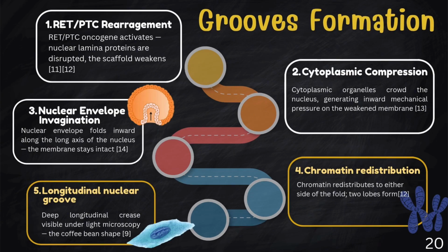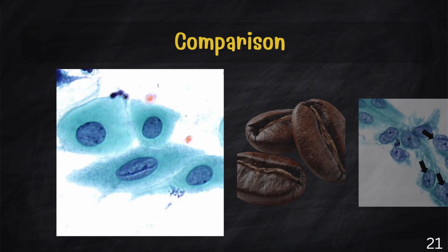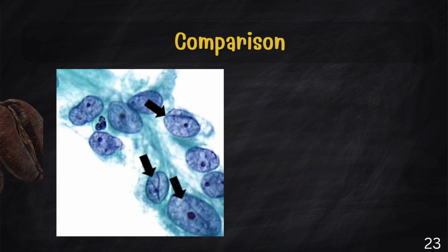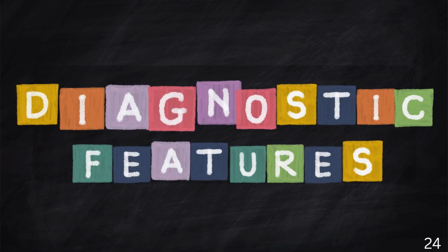It is important to remember that the groove is not an empty crack or a break in the nucleus. Instead, it is the optical appearance of the intact nuclear envelope folding inward. Now, I will explain the diagnostic features of nuclear groove in cytopathology.